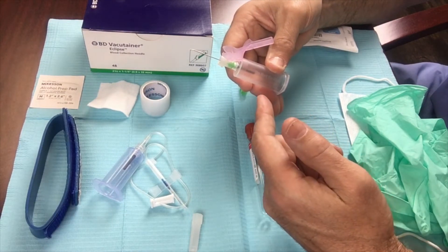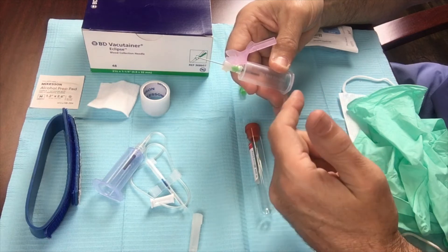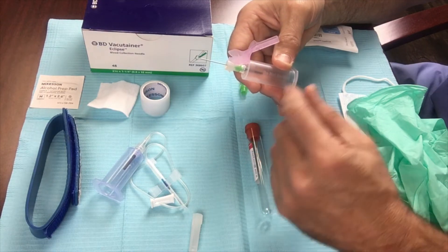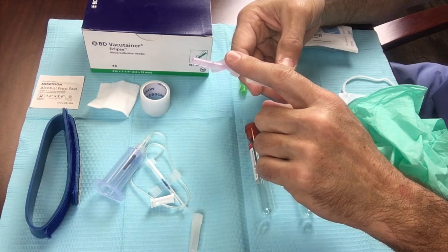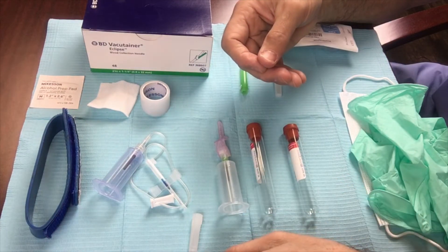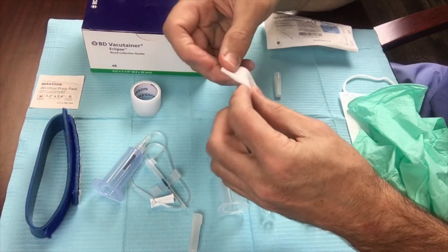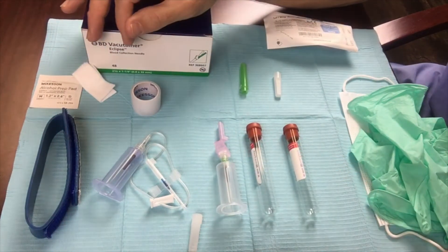You can do a direct access into the vein. I do have IVs started on most of my patients because I sedate them, so you can also use this to access a port on an IV and draw blood the same way. One of the beautiful things about this system is once you're finished and you withdraw the needle, you can snap the safety mechanism into place to keep you from having a needle stick. Once you remove the needle, you'll need a 2x2 gauze and Dermaclear tape — fold that up into a small square, place pressure, and tape it in place to help secure that access for hemostasis after your blood draw.